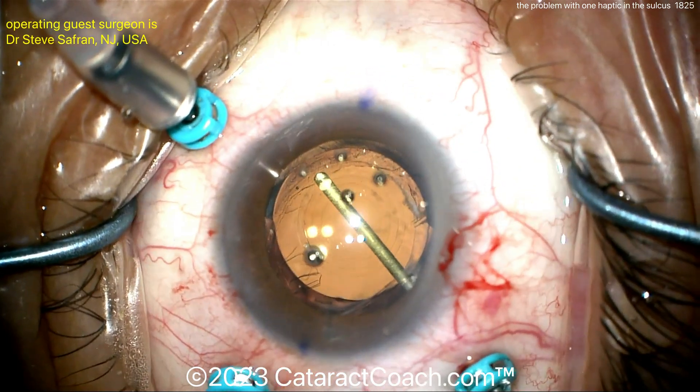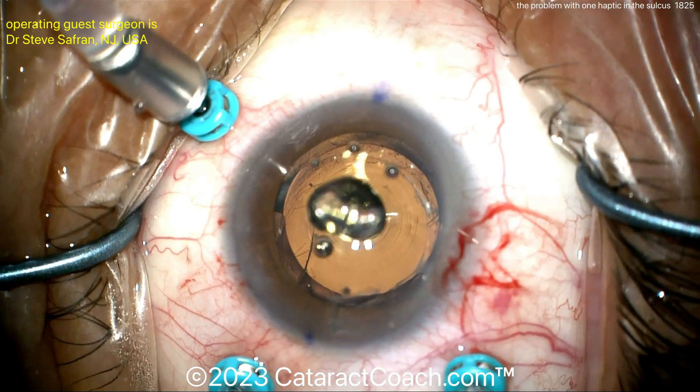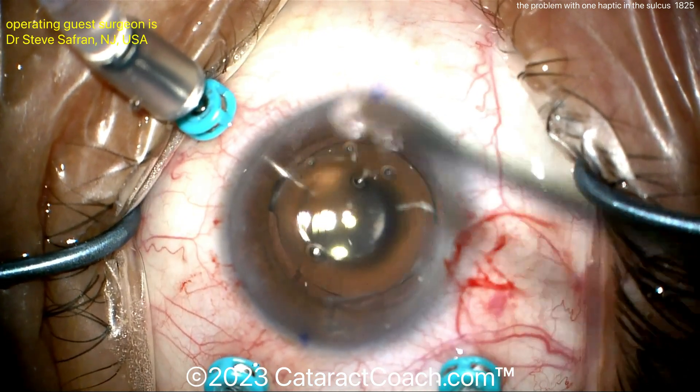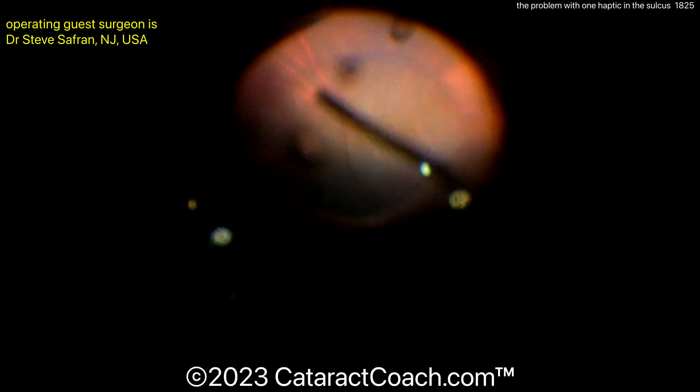Remember, the IOL is essentially supported by the good capsule support at the lens-capsule-bag equator. Cleaning up this central part to have an unobstructed visual axis. You can see the trifocal rings there — it looks like an Alcon PanOptix lens. And that's looking pretty reasonable. Now the surgeon is going to do a posterior vitrectomy, a full complete pars plana vitrectomy, to clean up all the vitreous.